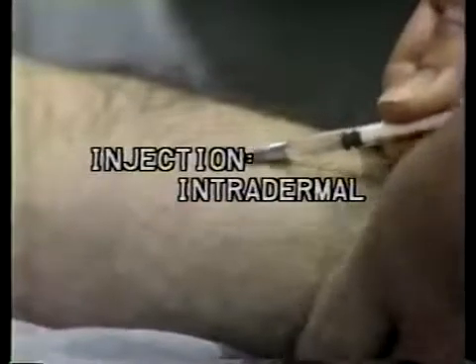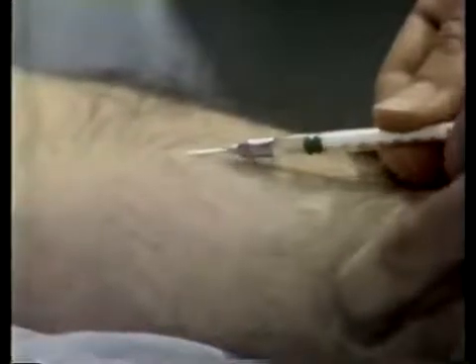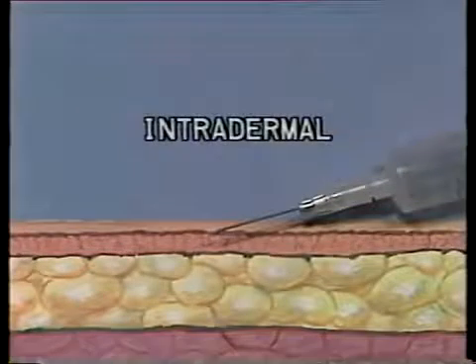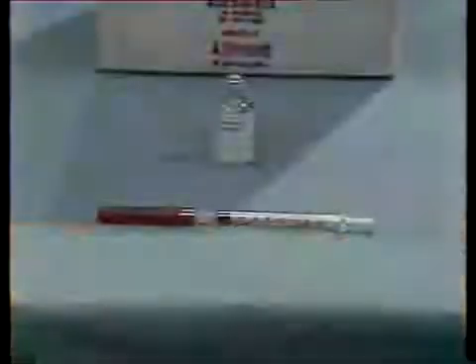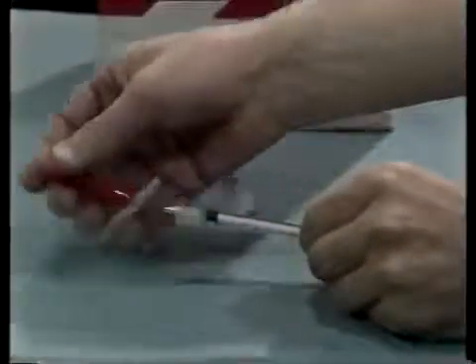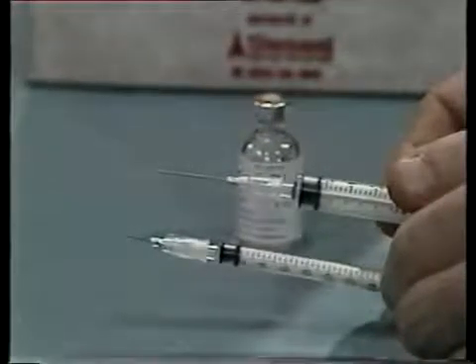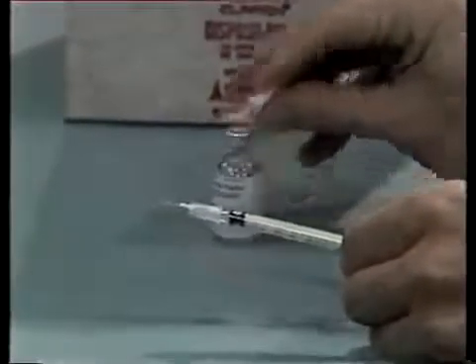Intradermal injections are commonly used for various skin tests for sensitivity to disease or allergies. The purpose of an intradermal injection is to introduce very small quantities of a solution between the layers of the skin — intradermal means within the layers of the skin. Since very small quantities are administered, you use a much smaller syringe and needle than for other injections. You prepare the needle and syringe in the same manner as for other injections, except that you should use the smaller tuberculin syringe.